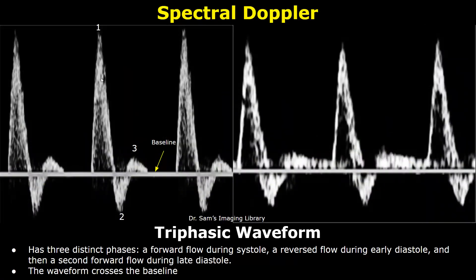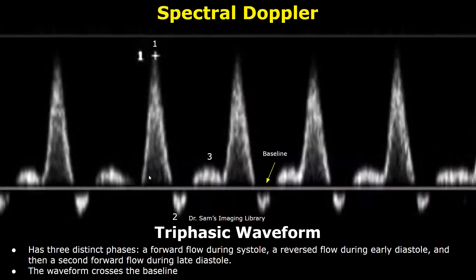Here is another example of a triphasic waveform. We have a forward flow component, then a reversed flow component, and a third forward flow component. The waveform has crossed the baseline. This is another example of a triphasic waveform — we see three distinct phases or components during a cardiac cycle, so we consider it a triphasic waveform.